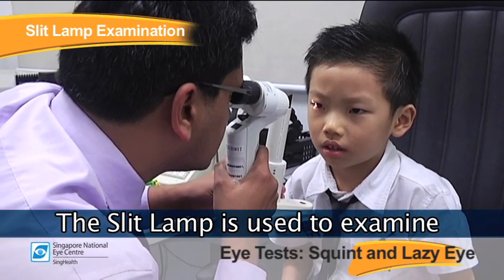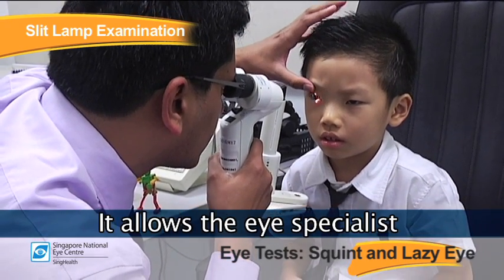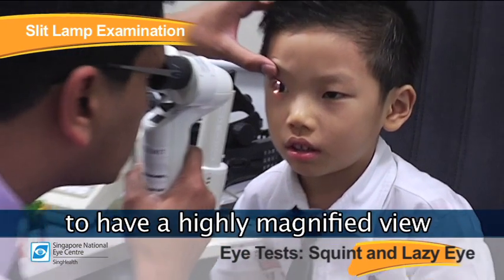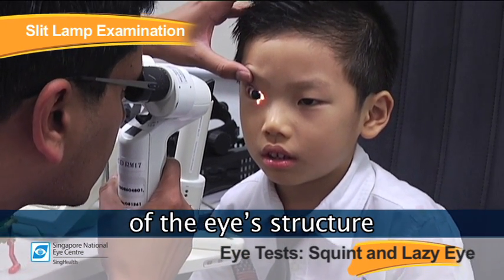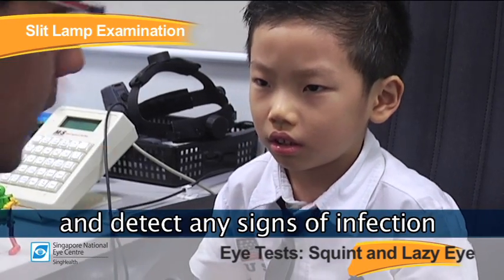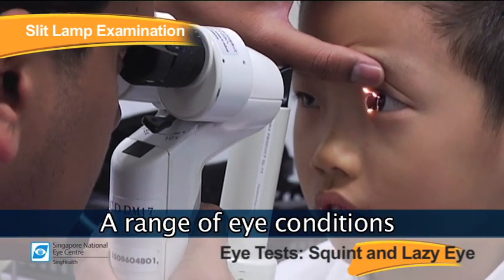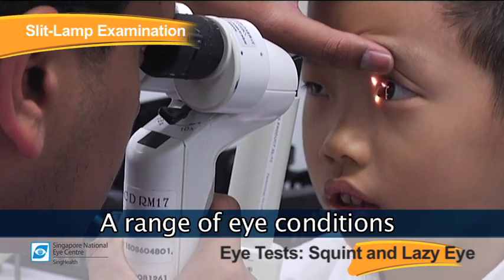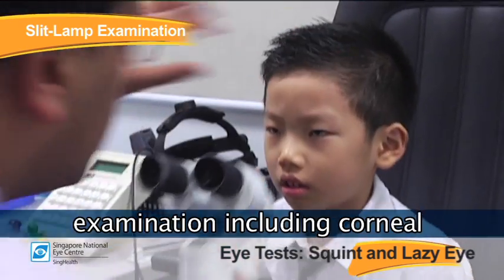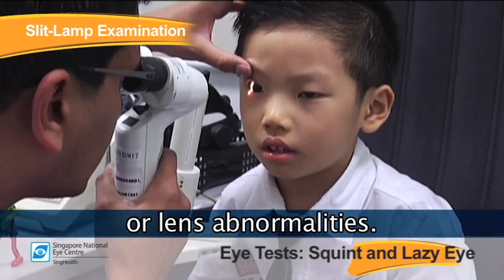The slit lamp is used to examine the front of the eye. It allows the eye specialist to have a highly magnified view of the eye structure to evaluate eye health and detect any signs of infection or disease. A range of eye conditions can be detected with slit lamp examination, including corneal or lens abnormalities.